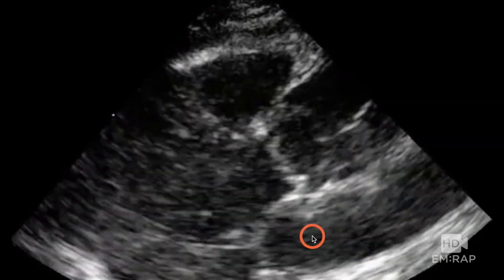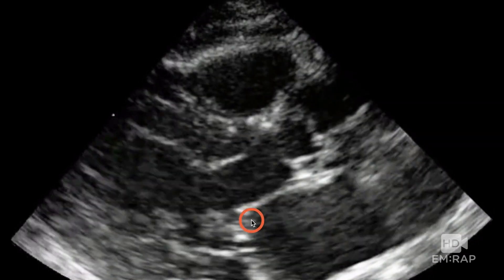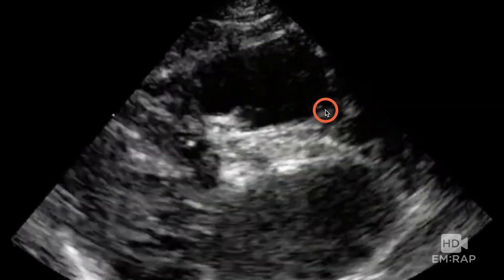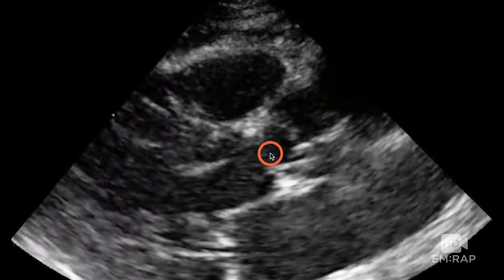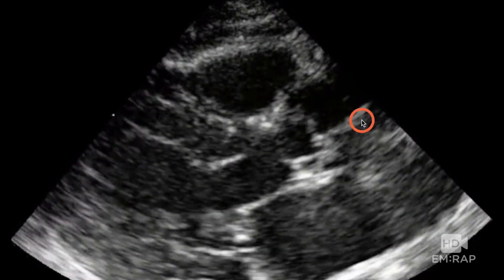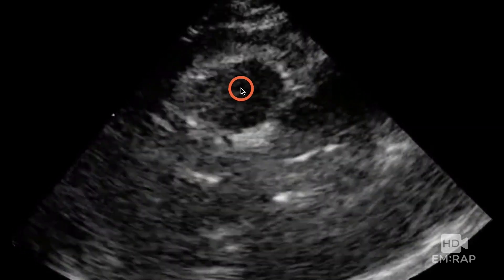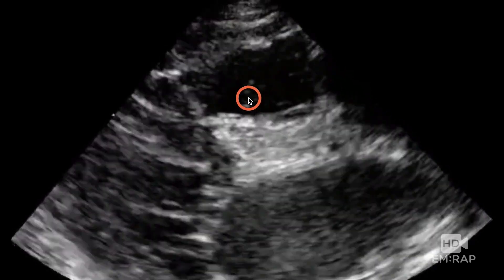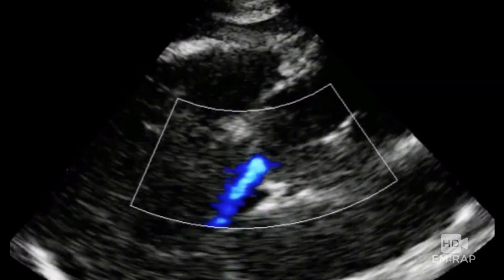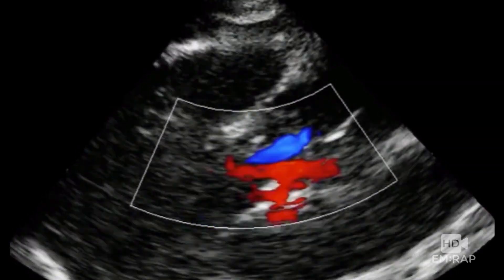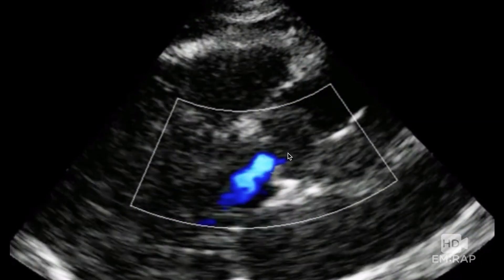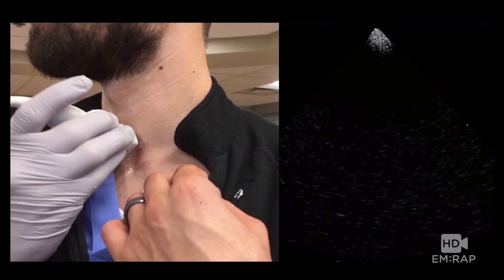Here is a parasternal long axis view of a patient with a dissection. We have the left atrium, mitral valve, and left ventricle going into the aorta. There's the aortic valve right here, and that little line right there is actually a dissection flap. This is the right ventricular outflow tract. You'll often see aortic regurgitation with this, although you definitely don't need the regurge to diagnose the dissection because you have the flap right here.